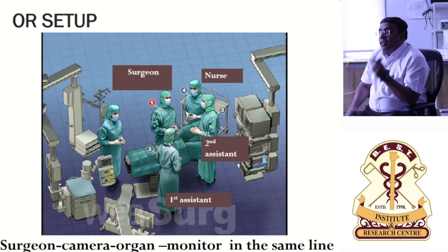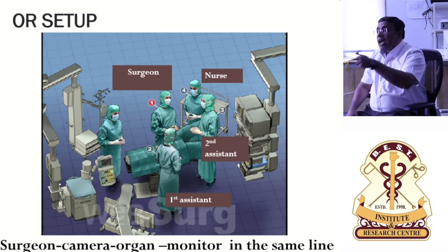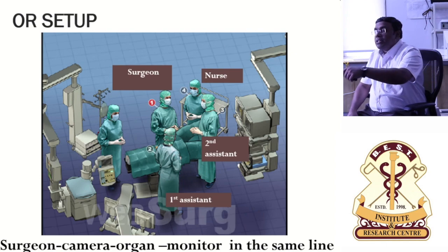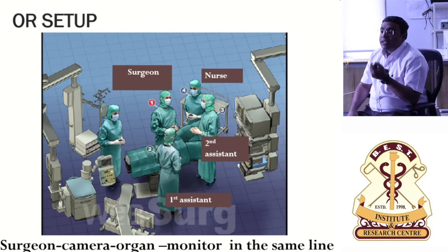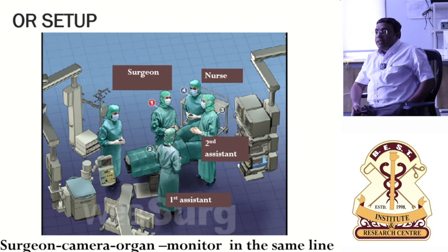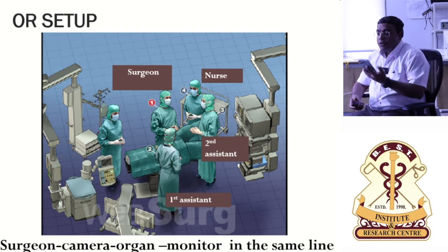But without your consciousness, you have to have a proper hold of the tissue, how much you are holding, with what pressure you are holding, get a good grasp of the tissue, so that even what is happening with the left hand is under your control. Generally, we don't do too much with our non-dominant hand, be it the right or whatever. Non-dominant hand is the one which we generally avoid doing work.